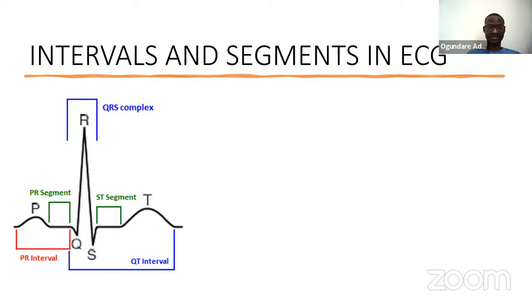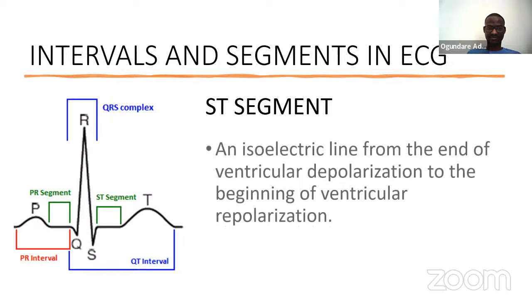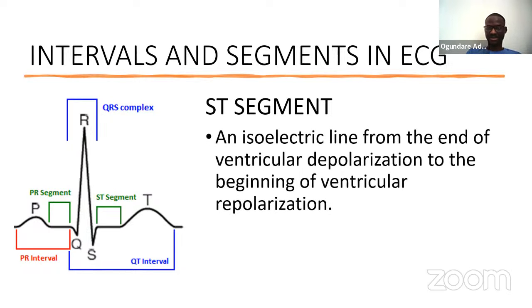So lastly on that is the ST segment, which someone already defined for us. So it's an isoelectric line. This looks like she just copied it from my screen. Isoelectric line from the end of ventricular depolarization to the beginning of ventricular repolarization. Absolutely fantastic.